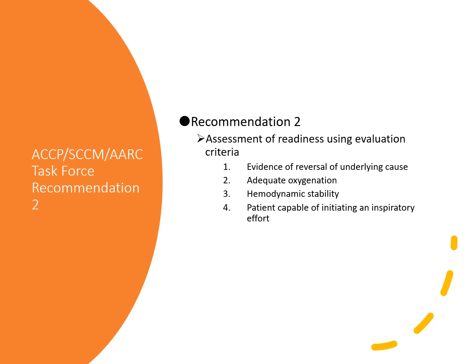That's a good idea that their diffusion's getting better. Let's say it's 150 to 200. That's a good idea that their PF ratio is getting better. Are they requiring high amounts of PEEP, or are they on a PEEP less than or equal to 8, right? Is their pH over 7.25, right? So look at these parameters.